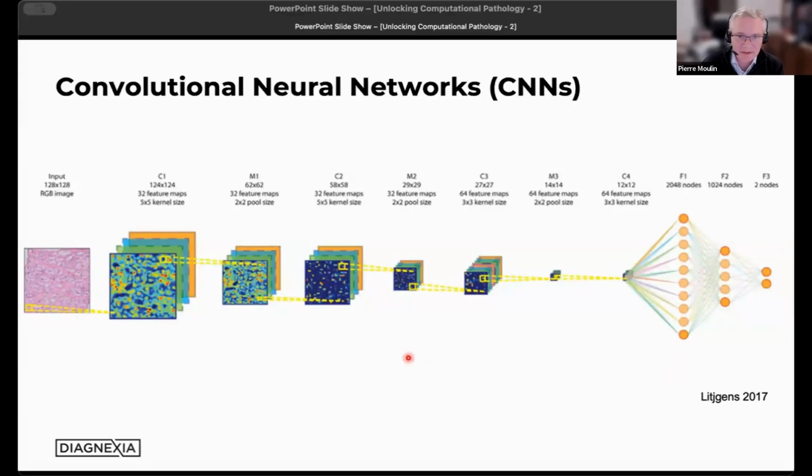These models in general can be expanded to a certain point to cover a range of resolution from 1 to 4, say. But we are limited in this by the size of the images we can inject into a computer, especially the part of the computer that does the calculation.